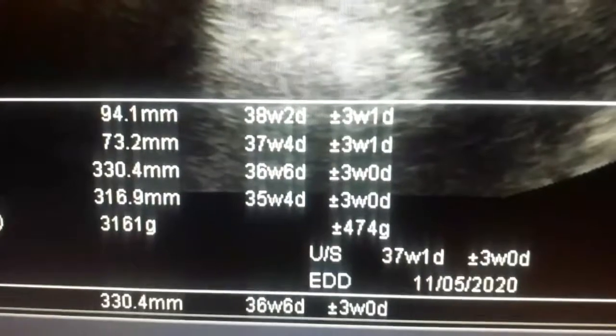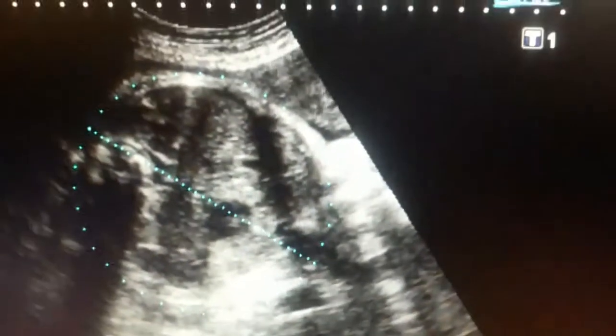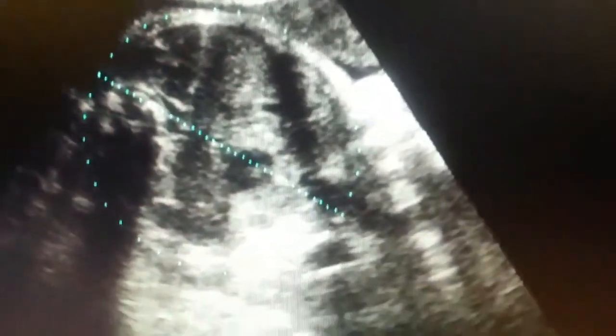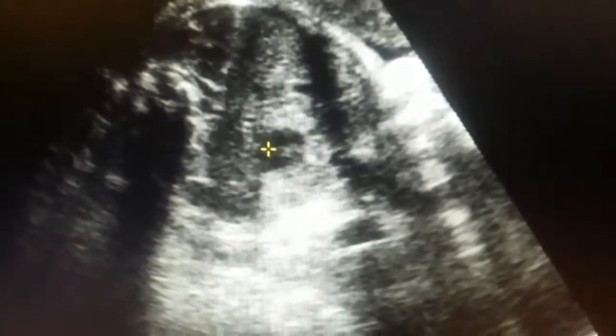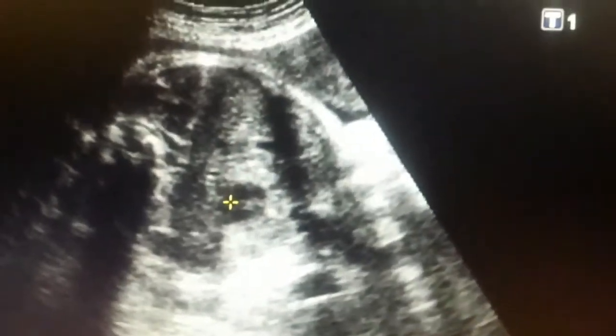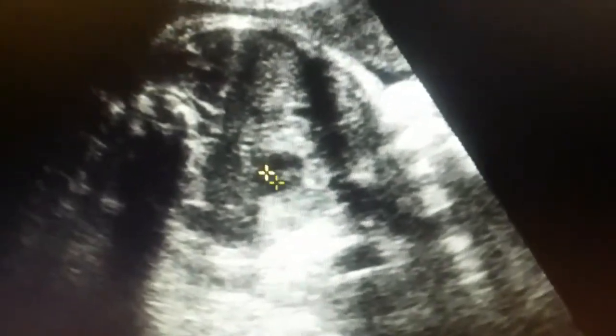Now look at the fetal weight — it is 3161 grams, plus or minus a few hundred grams. This is the gastric bubble, or stomach bubble, as the cursor indicates.